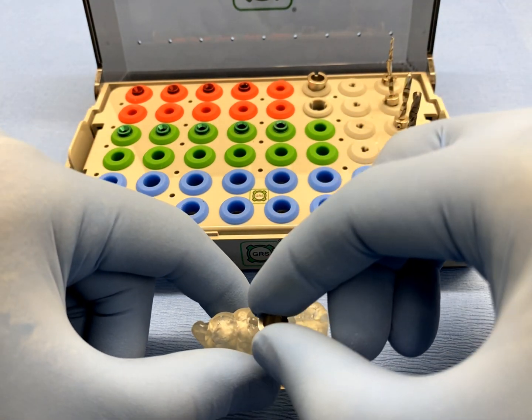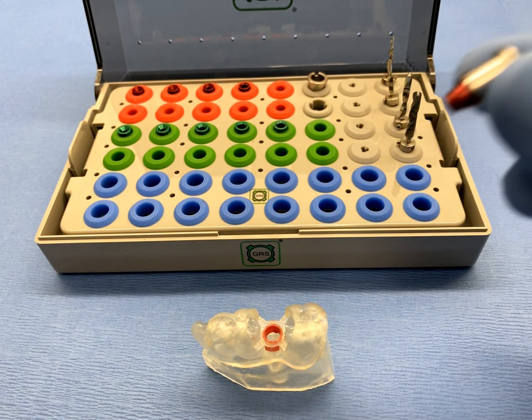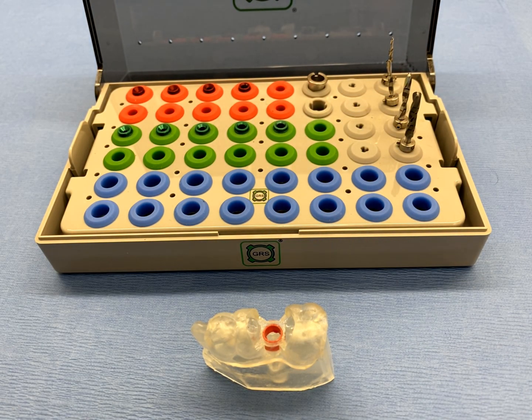Begin by removing the surgical guide analog with the IR tool and insert a surgical sleeve that corresponds with the initial pilot drill to be used.